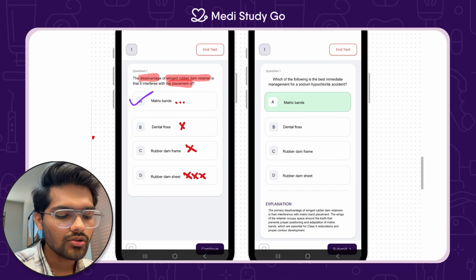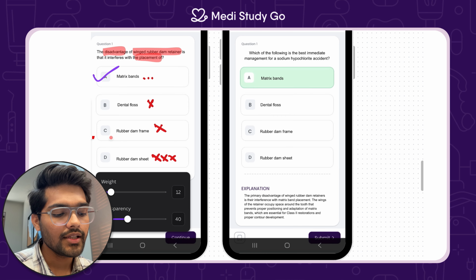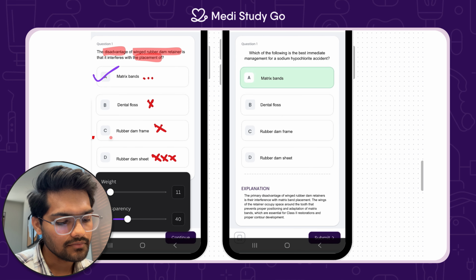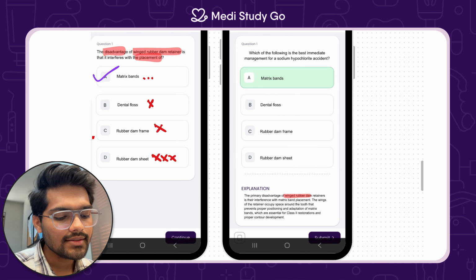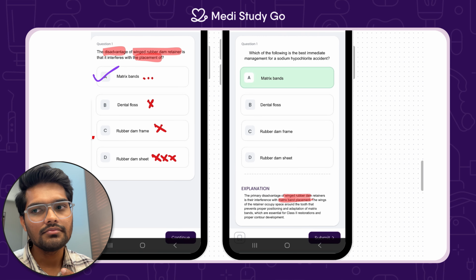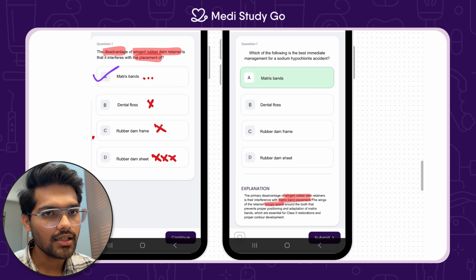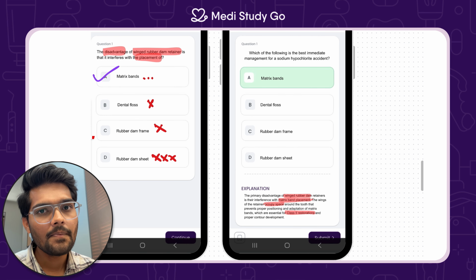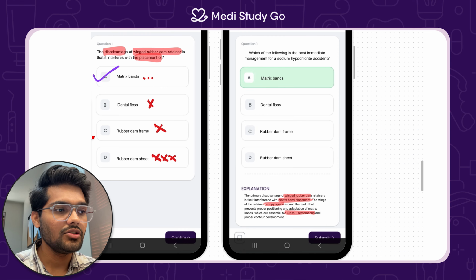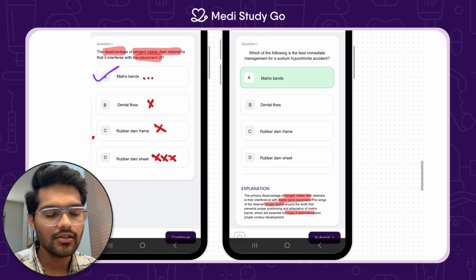And let's go through the explanation. The primary disadvantage of winged rubber dam retainers is that they interfere with matrix band placement. The wings of a retainer are going to occupy additional space, which is going to interfere when you place the matrix band. It is either not going to go inside, or it is going to be not very effective, or it won't be the right shape which you want it to be.